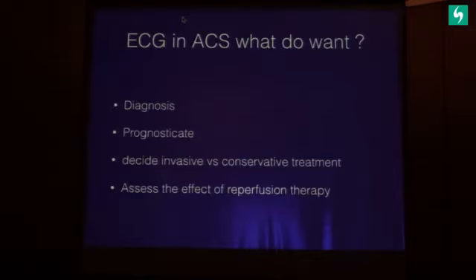Now this patient underwent a coronary angiography the same evening. This is the right coronary artery. You would see a tight stenosis here. This is the obtuse marginal, which is quite big, with a tight stenosis here, and look at this LAD. It has a very tight stenosis, and there is a septal which is coming down like this. This is the first septal.